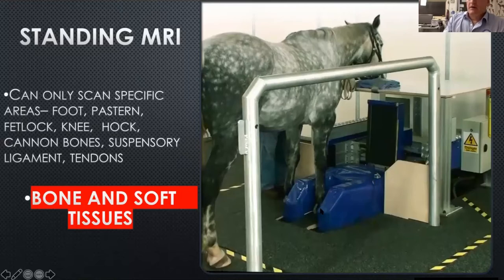The feet are great because the foot's stuck on the ground, but if you give too much sedation and the horse starts rocking forwards and back, we don't get very good images at all. So you have to be really patient in the MRI room. If everything goes well and we want to look at a foot and a pastern, we can be in and out in 45 minutes. If everything doesn't go well, we can be in and out in 24 hours.